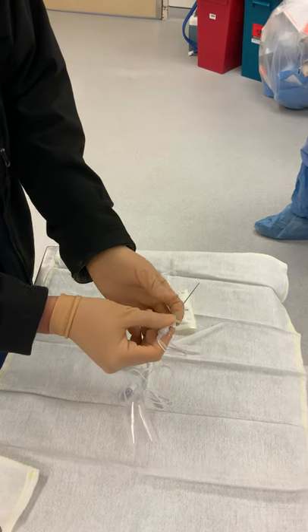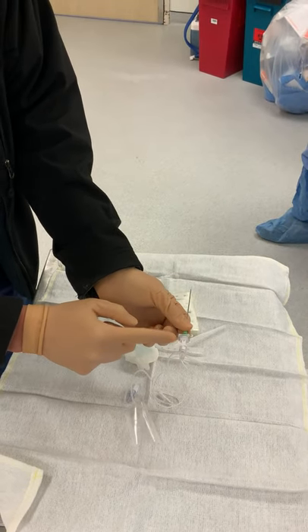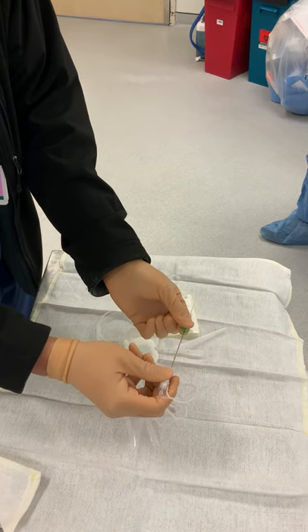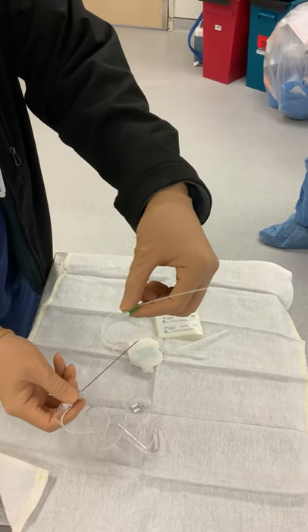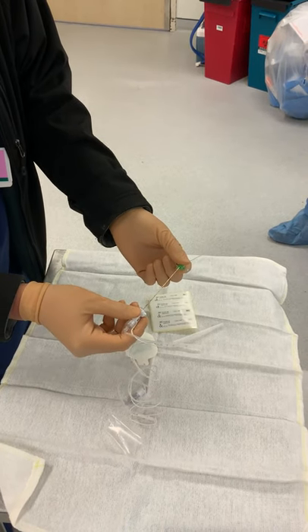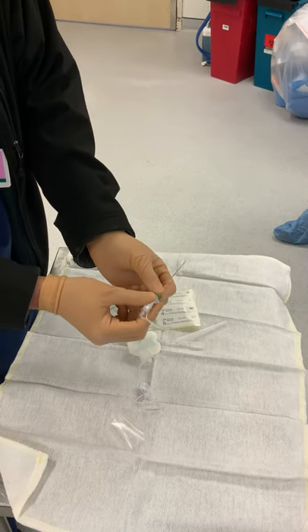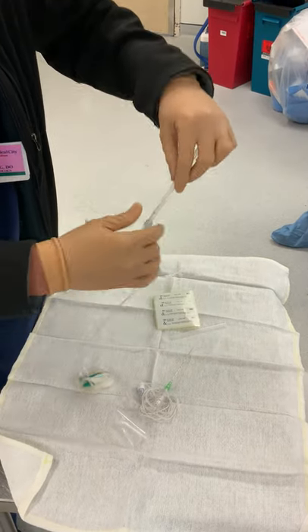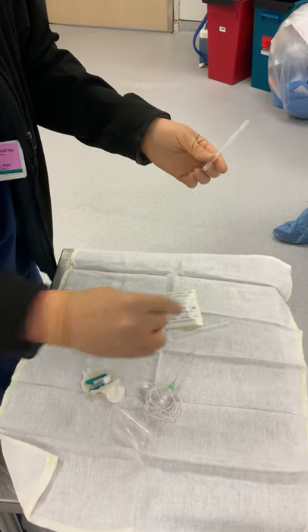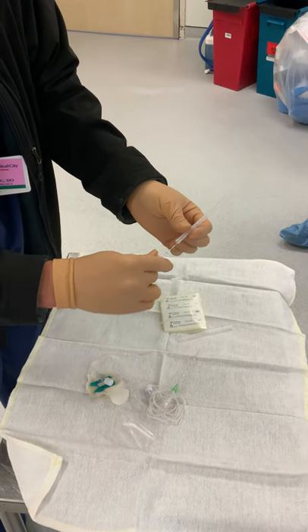Once we get the block into where we want it to go, you can disconnect the white from the green like so. You'll see that the needle comes out, and then you'll see this little clear sheath, which is where you'll be introducing the catheter through. That catheter will be this piece over here — this floppy catheter — and you'll just feed that through that clear sheath we just saw.